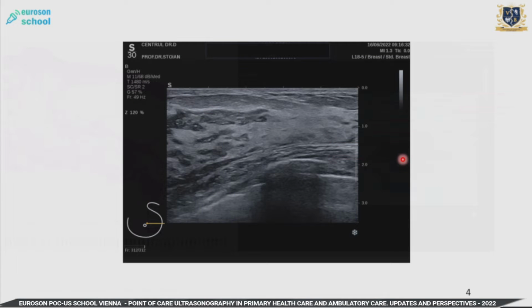What is nice in ultrasound, and we go then in that direction, the topic of today, indication. So again, the entire lobe. This breast was small enough for the entire lobe to fit in one section, so I did not need side by side, but it's a nice view of the entire epithelial structure, even the ductal structure, even with the interior line of the duct. So this is what ultrasound can give you. Very fine imaging, detailed imaging, which is very, very helpful.